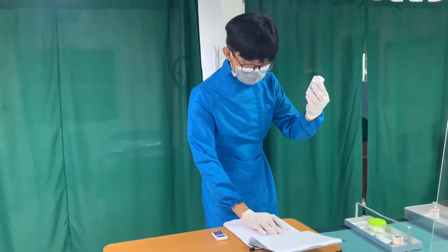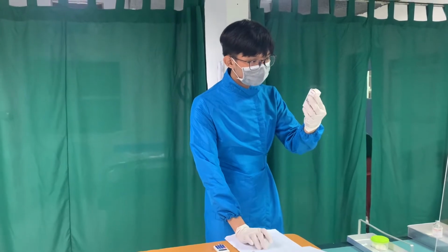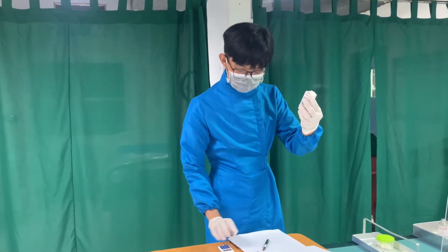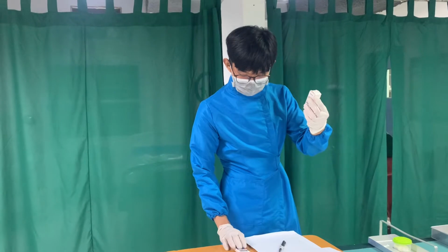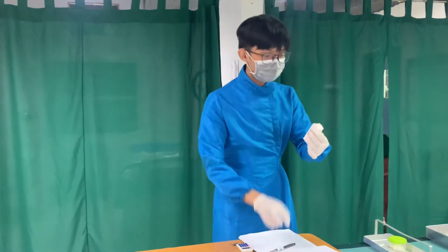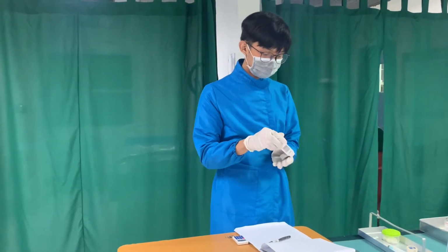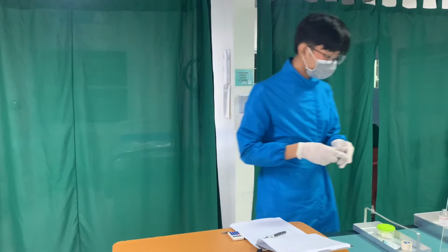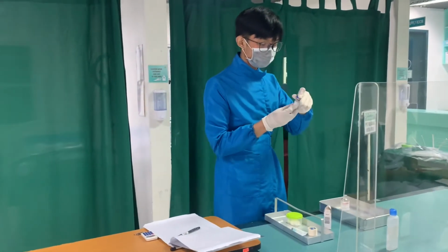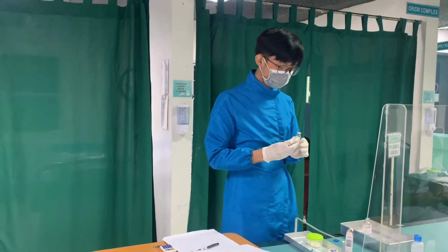Prepare medications for one patient at a time. Read the MAR and select the proper medication from the patient's medication drawer or unit stock. Compare the label with the MAR, check expiration dates, and perform calculations if necessary. Scan the barcodes of the package if required. Then remove the metal or plastic cap on the vial that protects the rubber stopper.